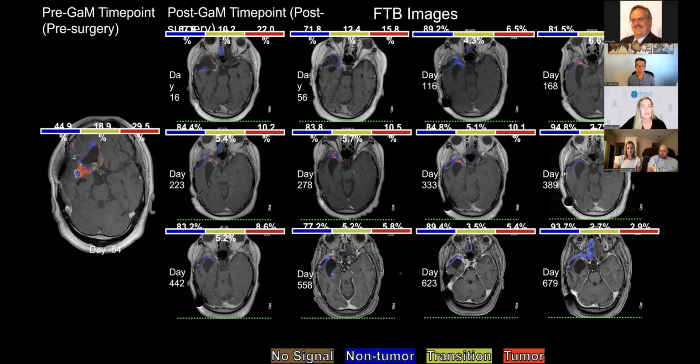It basically has been just published in the literature. When we talk about validation, you have the imaging technique, which is sort of the experimental, and then you have the histopathology, which is the ground truth, from the biopsy. In the context of my talk, when I talk about validation, it is really validating the imaging versus the ground truth.